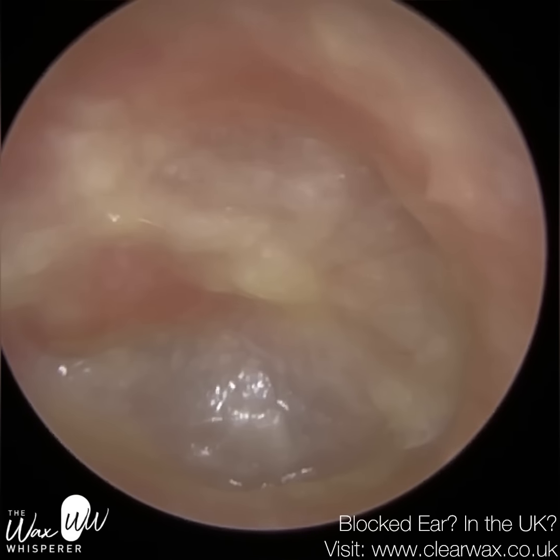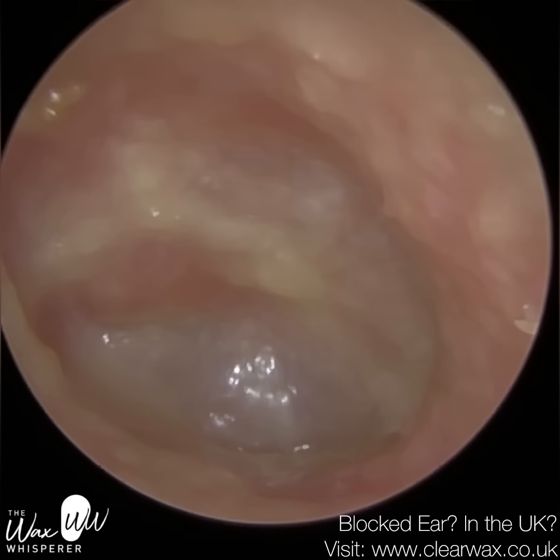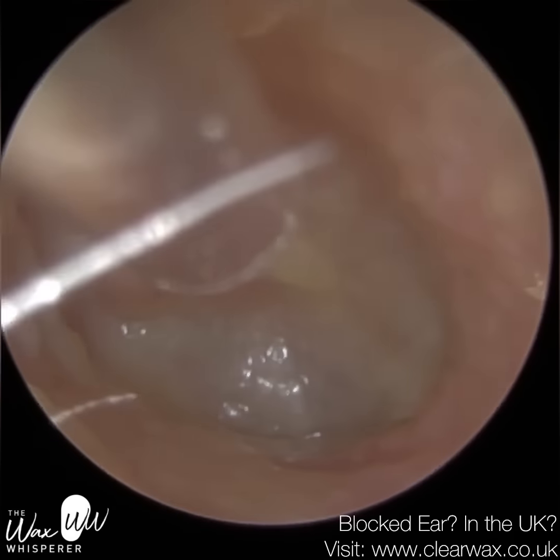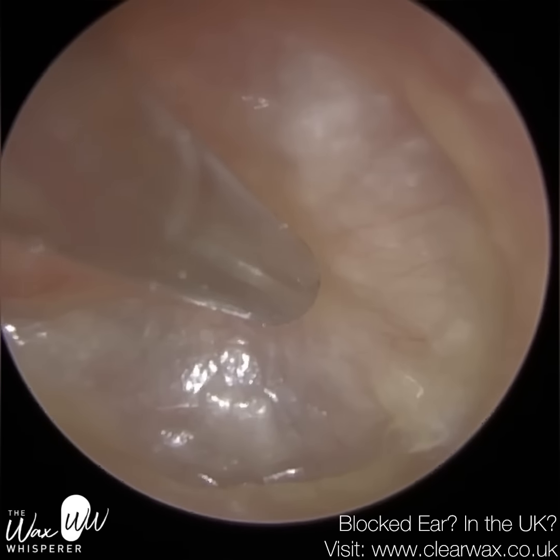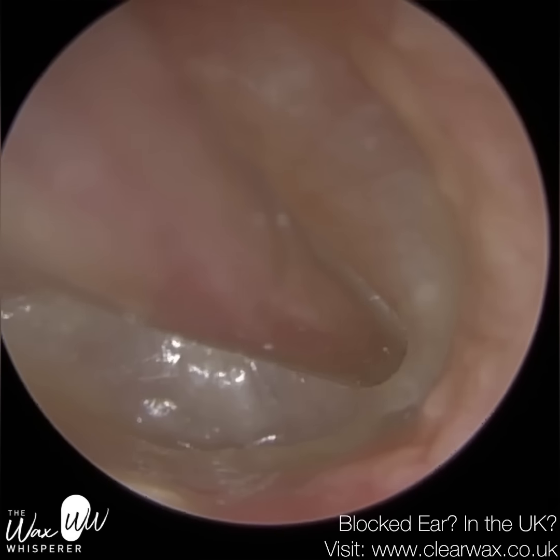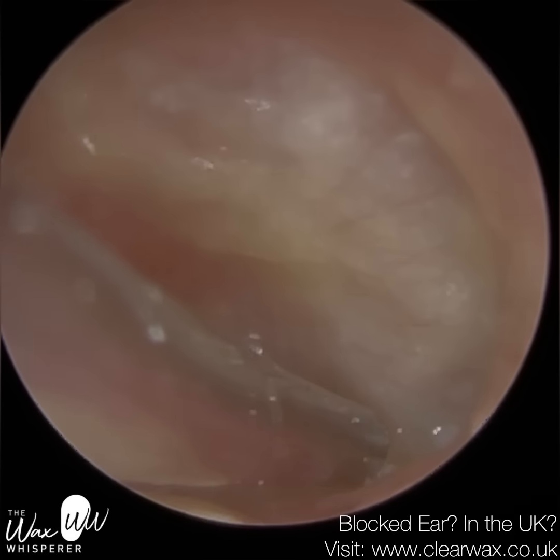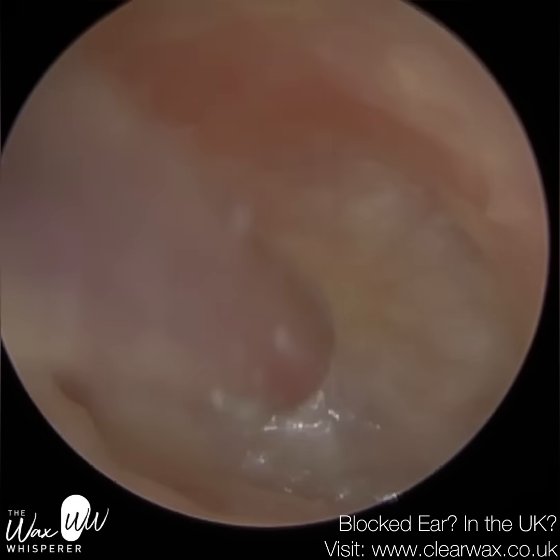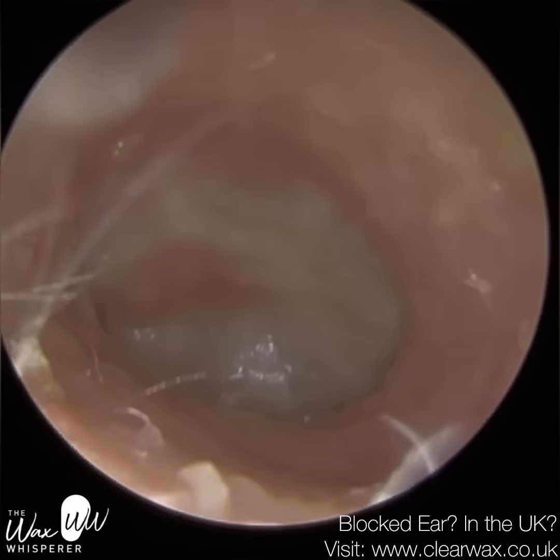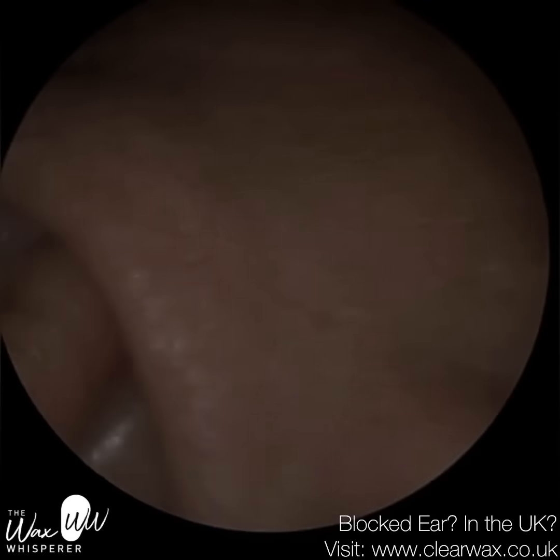And so I'm really happy with that. I can see the whole eardrum. There is a bit of debris just around the edge. I've got as much out as I can as safely as possible. Again, this patient's ear canal is inflamed, it's tender. So we're going to be really gentle and delicate. When your ears and the skin is inflamed and tender, it's more susceptible to damage. So we're just going to be very careful when we use any instruments, including the suction probe, because we don't want to cause any abrasions or cuts or lesions within the ear canal. So that's the left ear done.